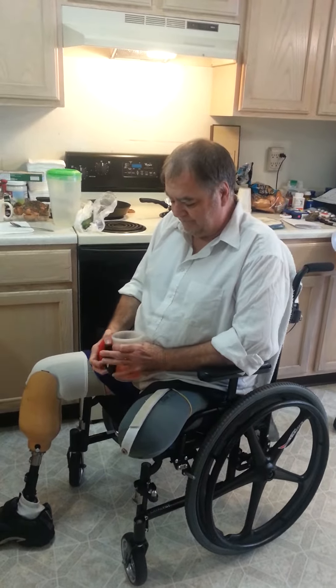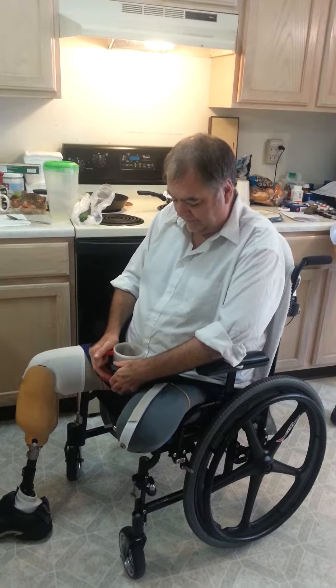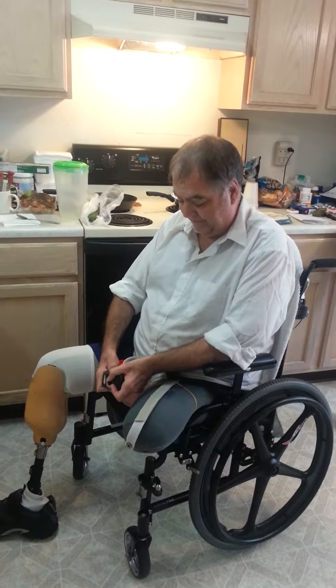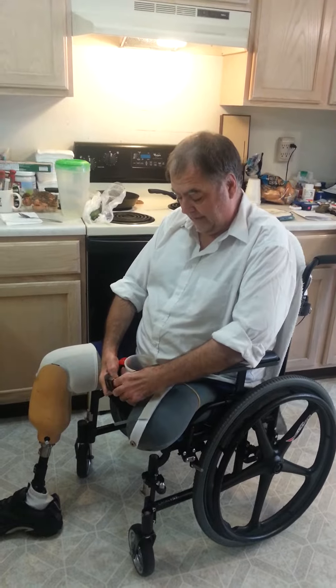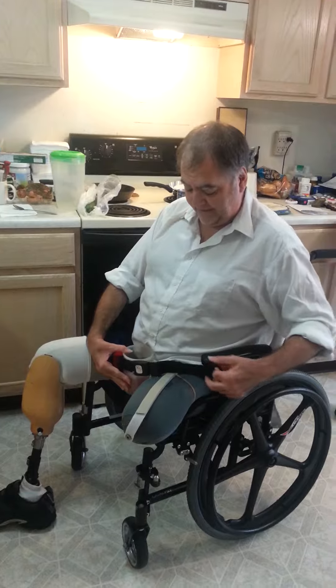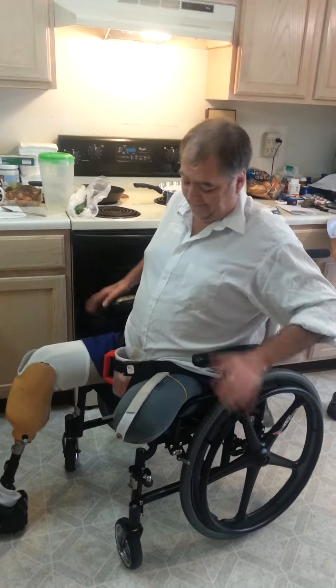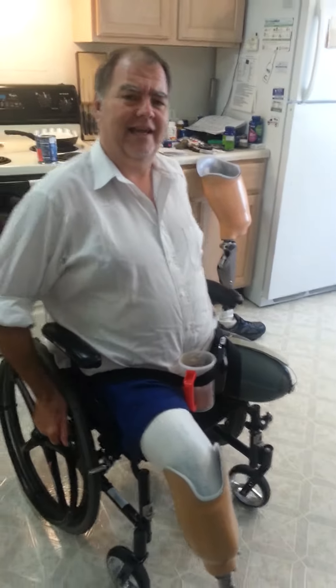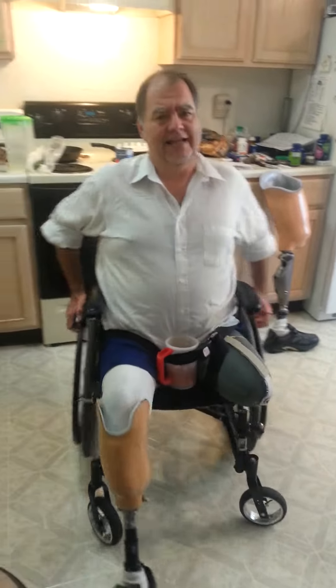Run my seatbelt through it. Set this thing down. Run the seatbelt through it, and pull it — not very tight, but tight enough to hold it still. It'll stay. I can use both my hands. I can get in and out. And that's dandy.